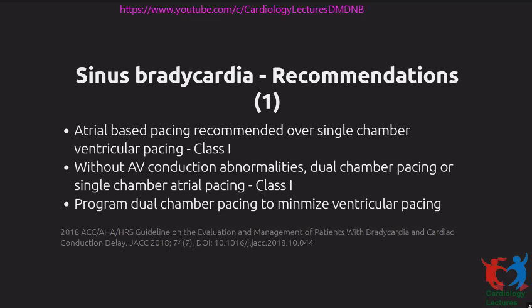Now, if you program dual chamber pacing, definitely try to minimize ventricular pacing. Previously, the only way to do this was to prolong the PR interval very long, or you had to put them in an AAI mode so that later, in case they develop AV block, you would have to reprogram them to a DDD mode. But now all devices have good algorithms to reduce pacing, from AV hysteresis to managed ventricular pacing and various other algorithms. So use one of these to minimize ventricular pacing.